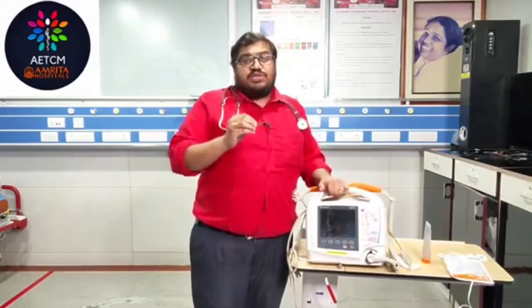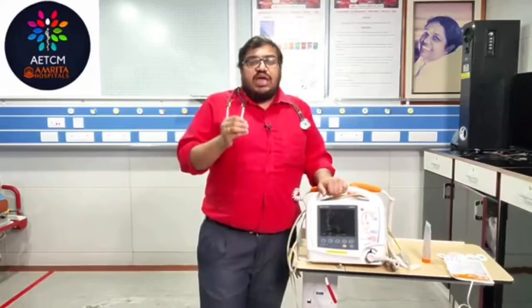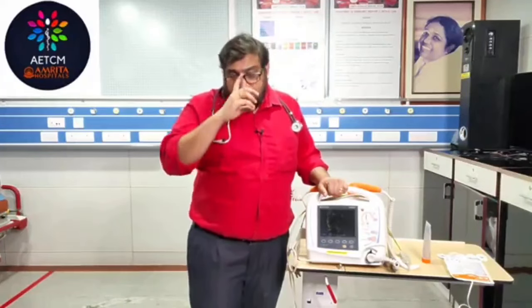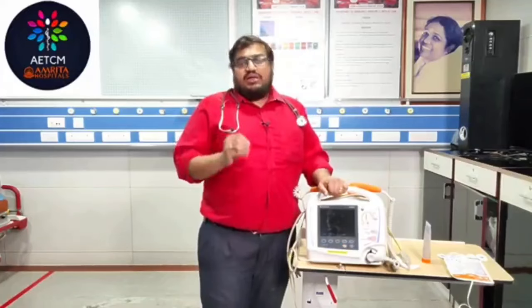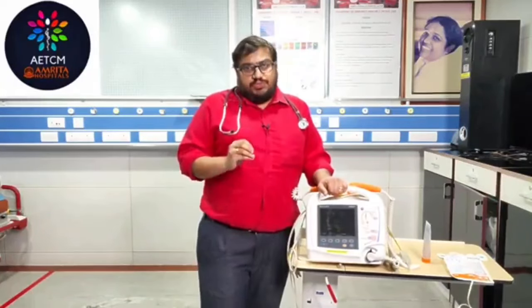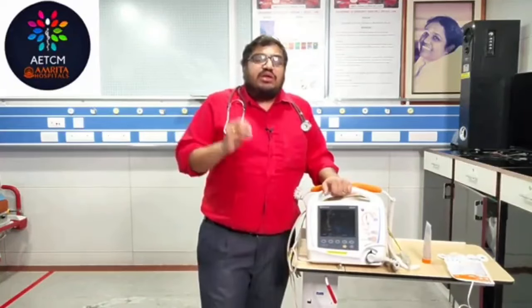So for that purpose, AHA in ACLS has decided that a narrow complex regular tachycardia, which can be an SVT, you need to start with 50 joules.